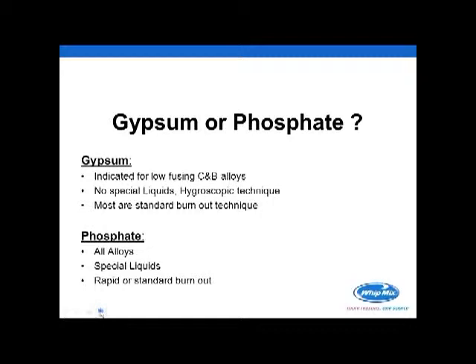being successful. Congratulations, but I'm worried about you. Unless, of course, that particular gypsum product has stated that you can use a rapid style burnout.